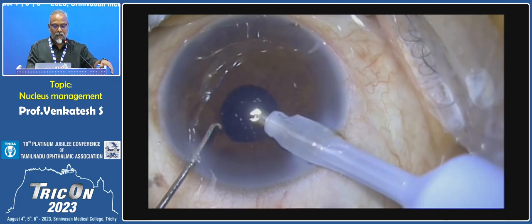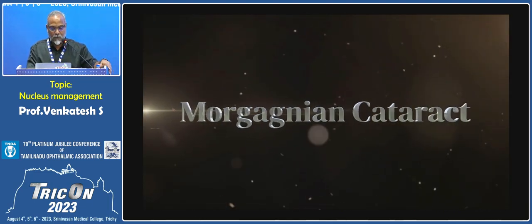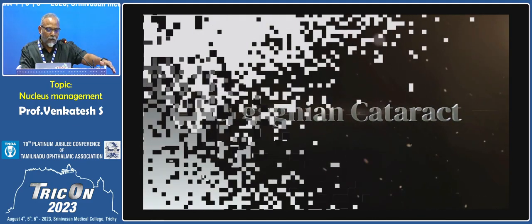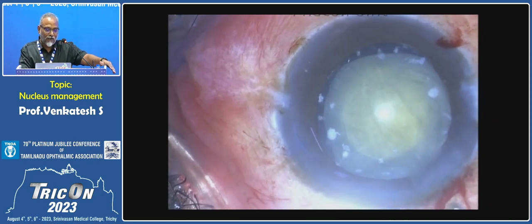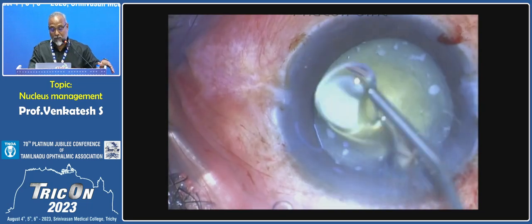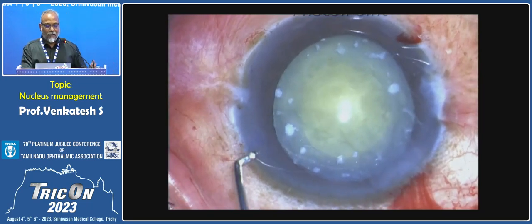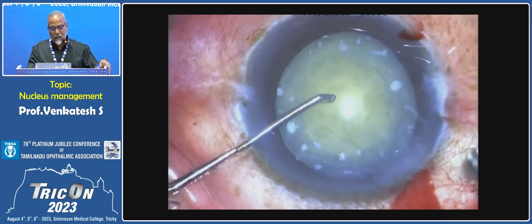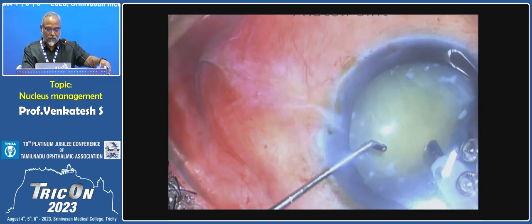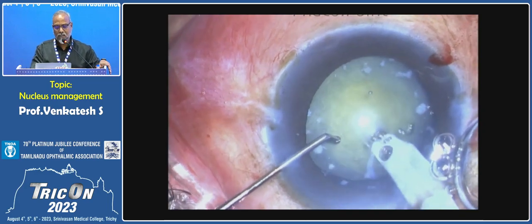So this is the end of the procedure, and everything has been done, and the pupil, of course, has become smaller. Let's move to a different case scenario. This is a Morgagnian cataract. The rhexis would, of course, be extremely difficult, but it is already completed. I'm going to show you just nucleus management. In these types of cataracts, I find that compared to direct vertical chop, the horizontal chop tends to score over the lens. This is a small, hard, mobile nucleus mass.